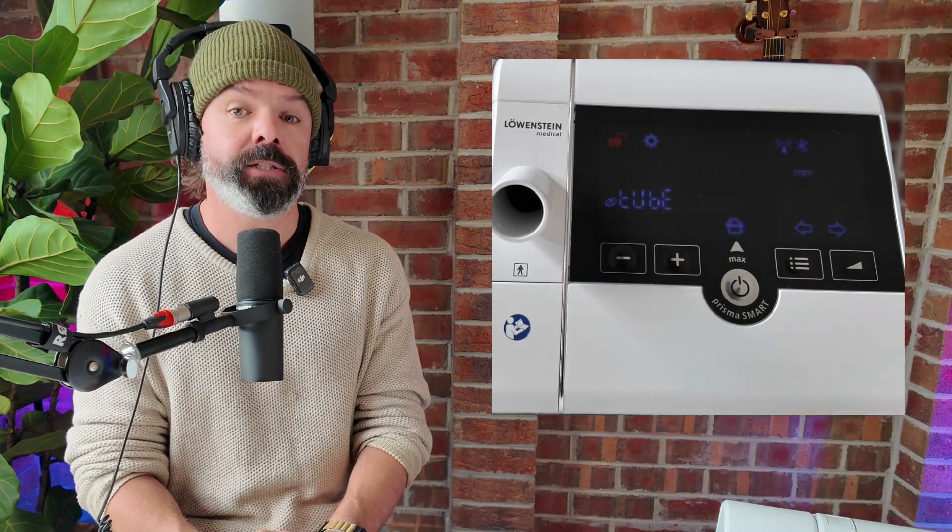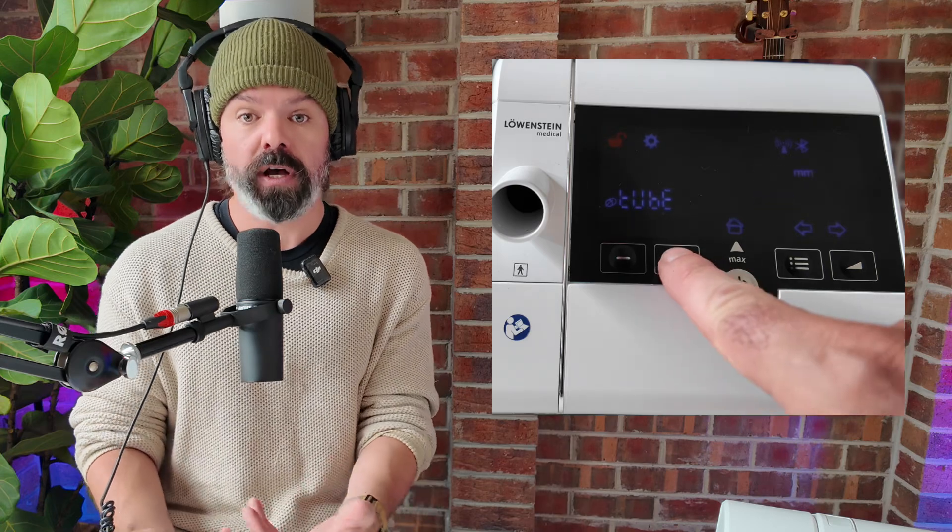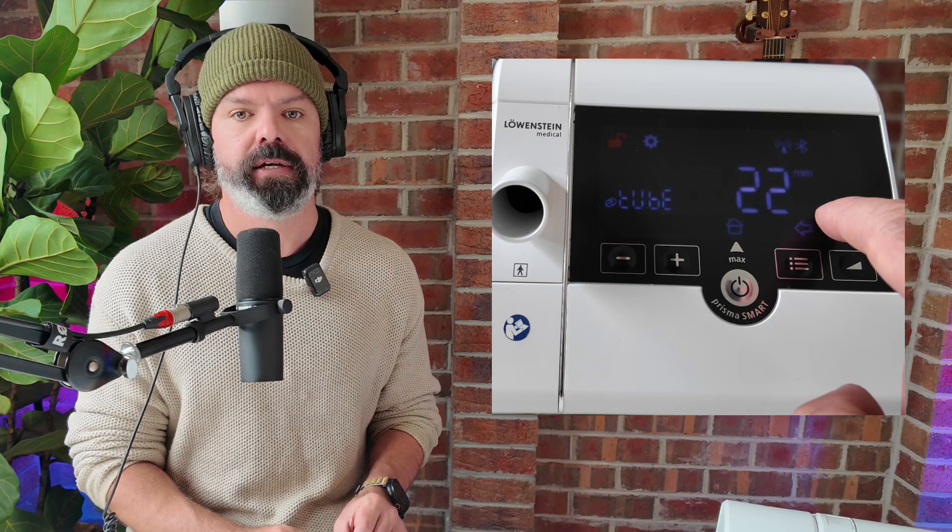Next, we have the tube setting, and it's extremely important that you get this right. Select the correct tube size to match the tube you're actually using. You don't want to end up in a scenario where you're using a 22 millimetre tube but in the settings it's set to 15 millimetre, or vice versa, because it will completely throw off how the device regulates the pressure and your comfort. What often happens is a clinician will set up a patient with the right tube size, but then the patient goes off and buys another tube online, puts it on, and everything goes haywire. So just make sure you get that setting right. Providers can also lock patients out of some of these settings, so if it's locked you'll need to unlock it in order to change it.